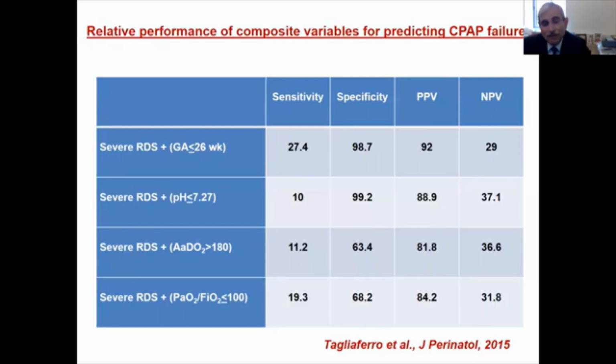So if you are unfortunate that you get a septal injury, or if you get a baby from an outside hospital, which is very common, that there is a big septal injury, those are the scenarios where we would use a nasal mask. But in small babies, it's all binasal prongs. If the septum gets damaged and you don't want to intubate the baby, because we do nasal intubations too, all our intubations are nasal. So with a septal damage, if the baby needs to be intubated, it will be an oral intubation. If we can get away with CPAP, we would do mask CPAP.